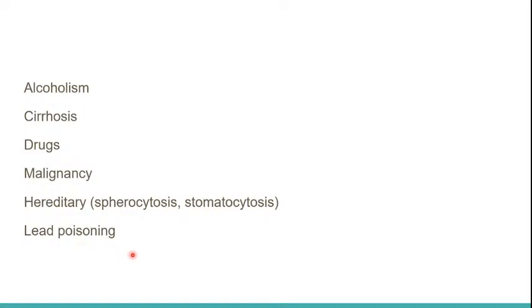Remember, I've mentioned before that each cell anomaly that we look at here will not necessarily be just one RBC anomaly. There could be five RBC anomalies or poikilocytes out there, so it could be more than one.